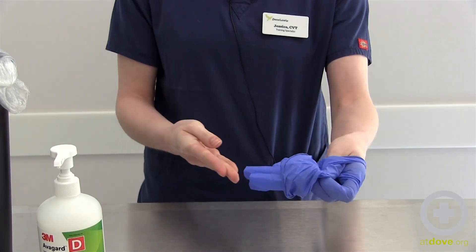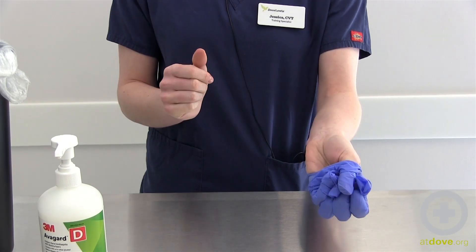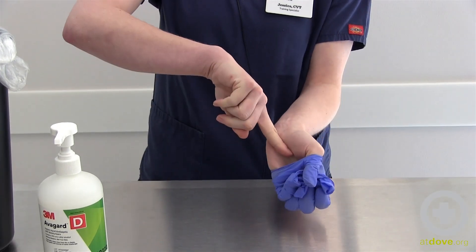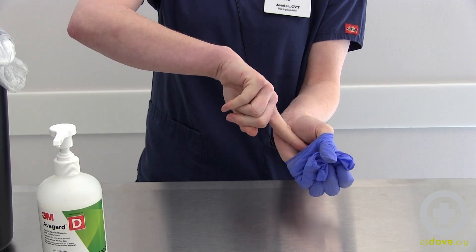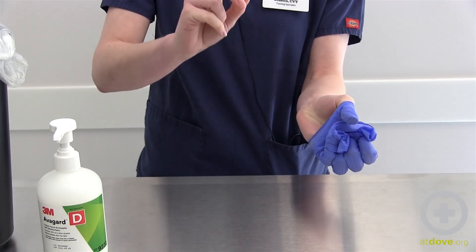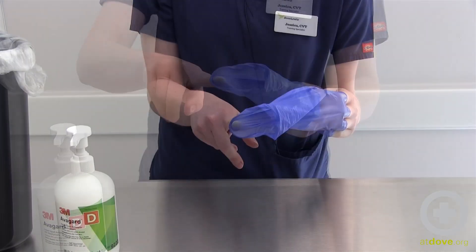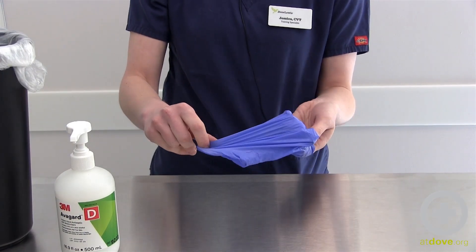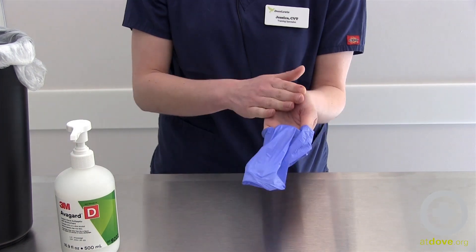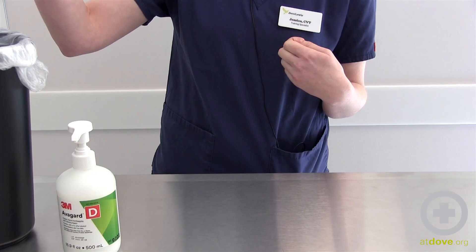Now I can slide this glove off and hold it bundled up in the dirty part of my other glove. Then slowly and carefully slide my finger inside my glove, because inside my glove is considered clean and my hand is considered clean. Take it, tent it, and pull it off. I can continue touching the inside of my glove — which is now actually the outside because it was touching my hand — and pull that part off and put it into the garbage.